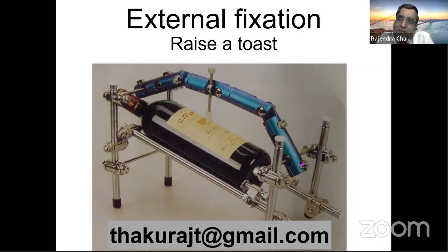There is another interesting question from a surgeon who says, if the fixator is stable, the fracture configuration is stable and non-union is there, will it heal with bone grafting alone? Fixator and bone grafting alone? Yeah. So a fracture which is initially treated by... You do bone grafting and hope for the best.